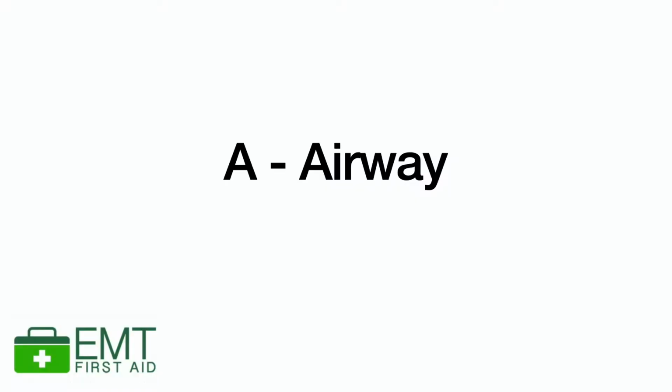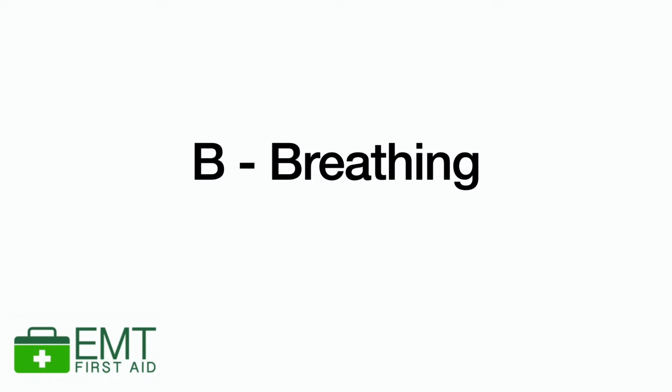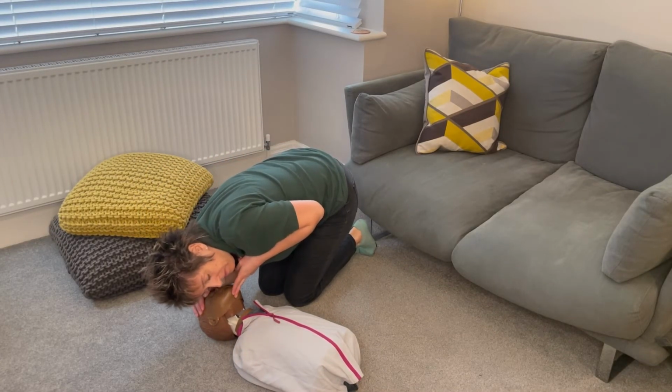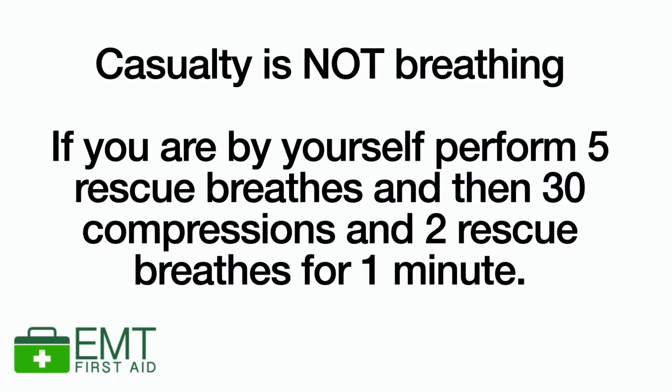I will then open the airway by doing a head tilt and a chin lift, and I will look, listen and feel for breathing, normal breathing, in 10 seconds. This casualty is not breathing, so because it's a child, I'm going to do 5 rescue breaths.